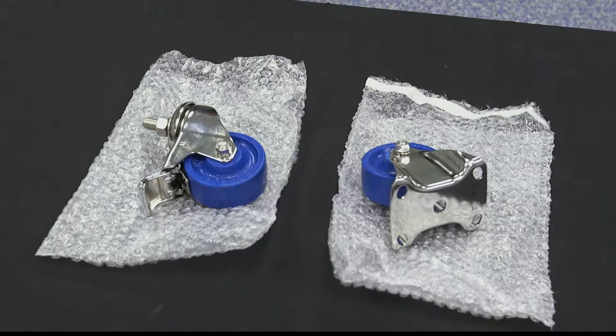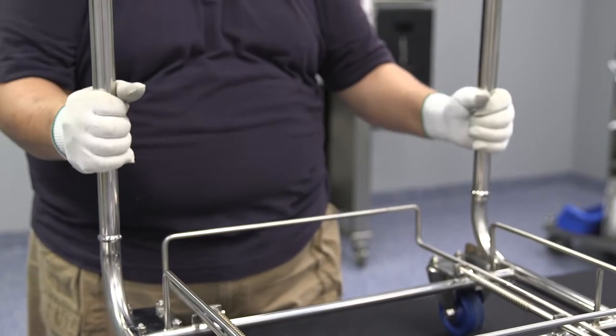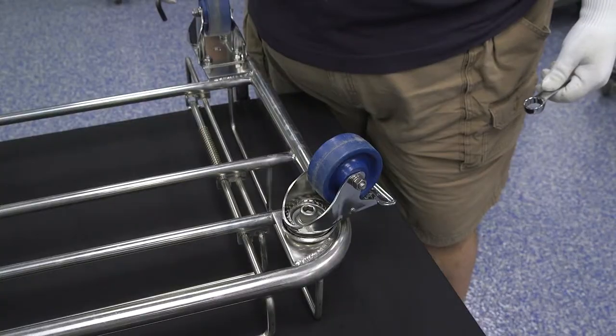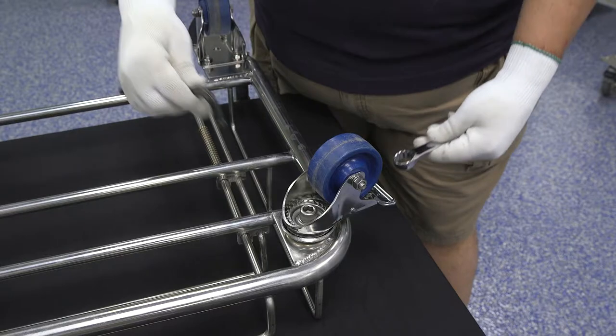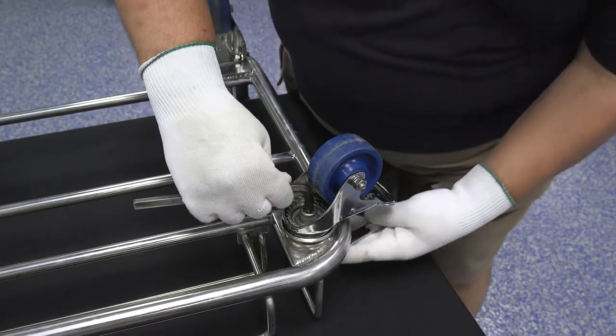Take your trolley to a suitable work surface outside the clean space. Remove the handle from the trolley. Turn the trolley over and place it on top of the work surface with the casters facing up.